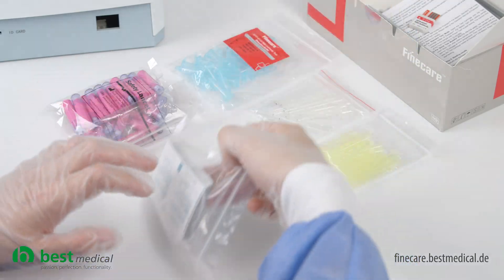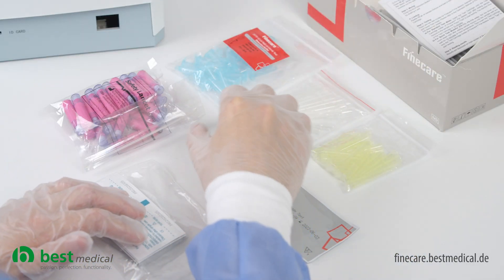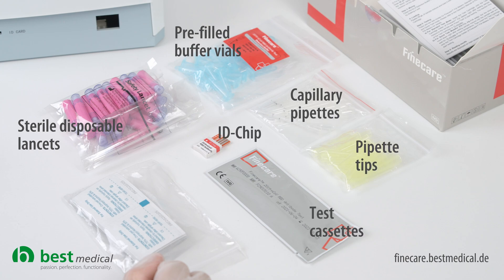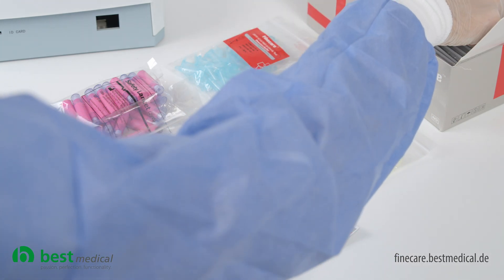Included in the scope of delivery are: sterile disposable lancets, pre-filled buffer vials, capillary pipettes, pipette tips, antibody test cassettes, ID chip for identification of the test type, disinfectant wipes, and instructions for use.